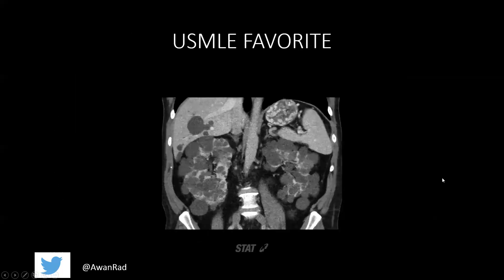A big USMLE favorite is the high association of berry aneurysms with autosomal dominant adult polycystic kidney disease. This coronal CT image of the abdomen shows enlargement of both kidneys, which are replaced with simple cysts — these hypodense structures. There are some cysts in the liver as well, but the dominant finding is enlarged kidneys with simple cysts in autosomal dominant polycystic kidney disease.